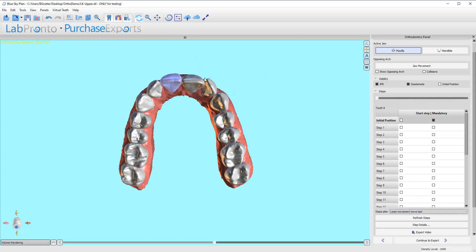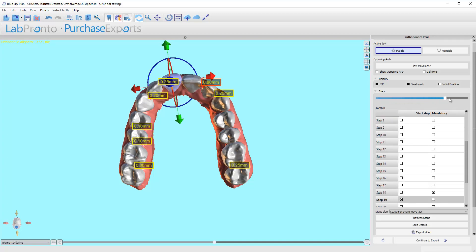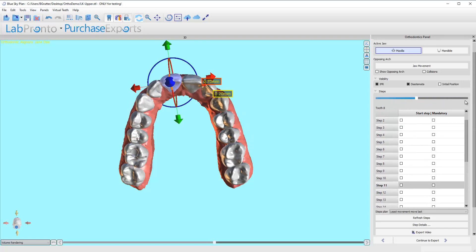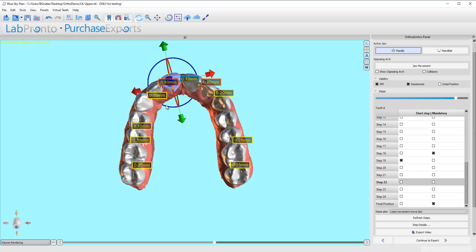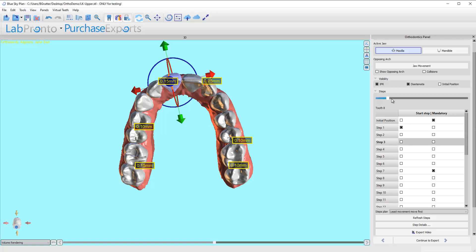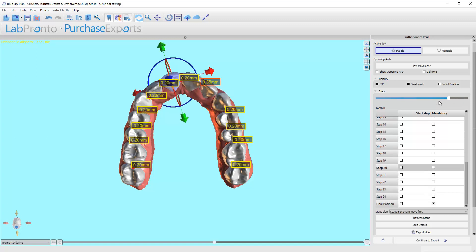The biggest issue that's created is the contact between this central incisor and this lateral incisor. As that lateral turns in, that central hasn't gotten out of the way, so it creates a very heavy contact before it moves out of the way. That's the biggest area that is concerning to me. This one right here is concerning, but nowhere near as concerning as this one. If I instead go to this one where it does the least movement first, it helps improve that quite a bit. It doesn't fix it — there's still some heavy contact — but it's far better.